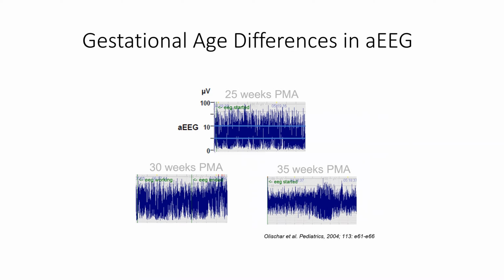that we don't have enough cycling, we don't have enough continuous activity. The lower margin is not reaching up towards that 5, and that is not normal. So it is still considered ill, even though it is, you know, not a term baby brain. So just trying to make sure that you're thinking about that as we have expectations that the aEEG will improve with time.